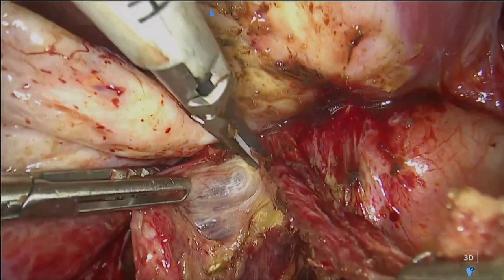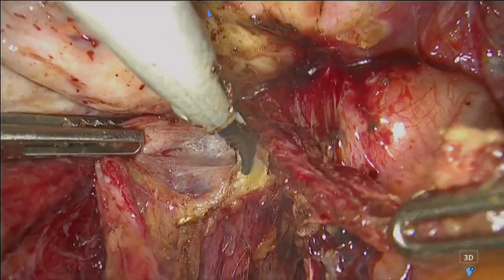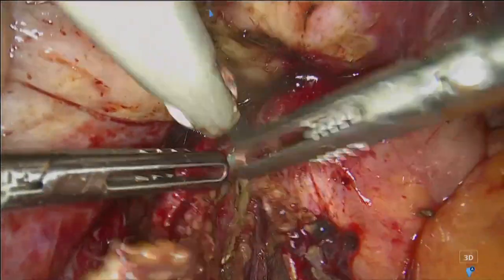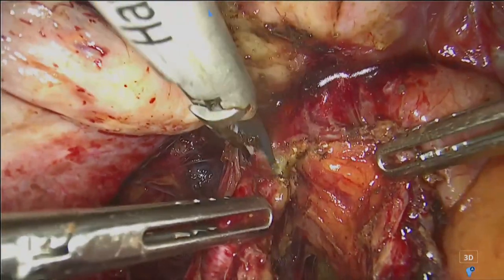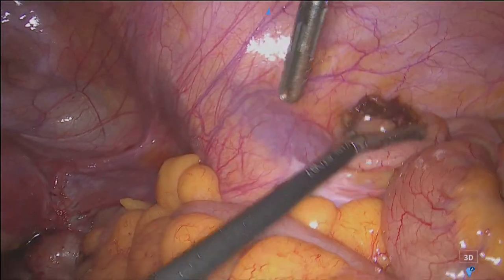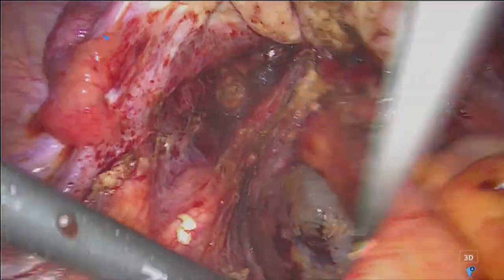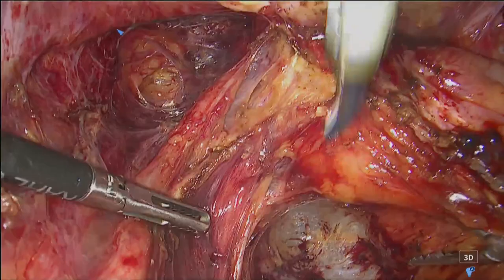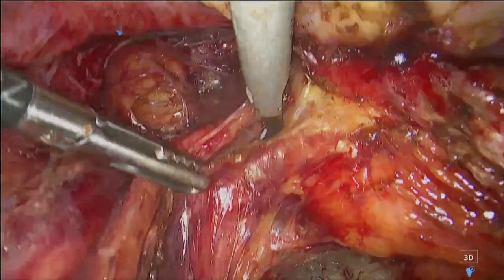The anatomy is very clear now. Soft tissue, no infiltration in this more lateral part. The nerve is down, and we can start to remove this first part of the nodule with the lateral infiltration. And this is the left periureteral nodule. And so, on the left, very good vision of all the neural part. You see from here the hypogastric nerves, the branch.